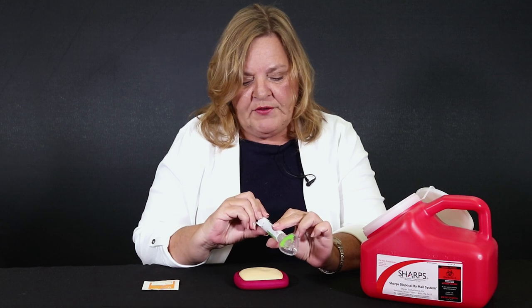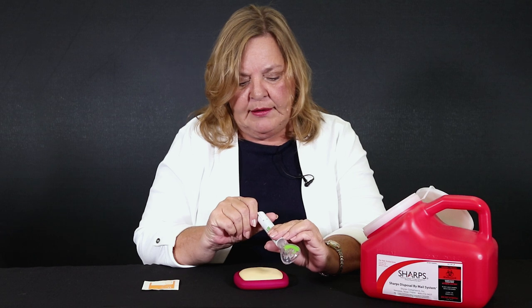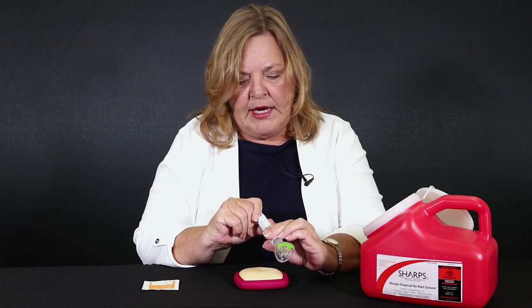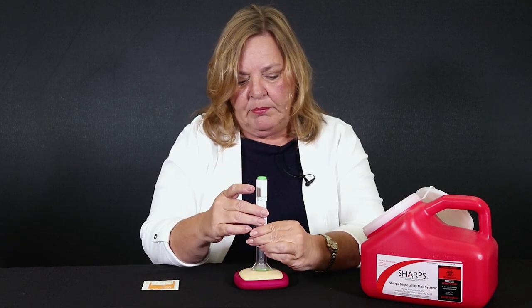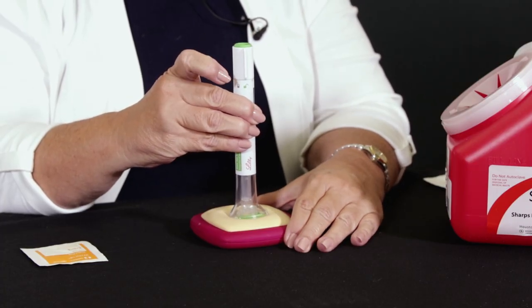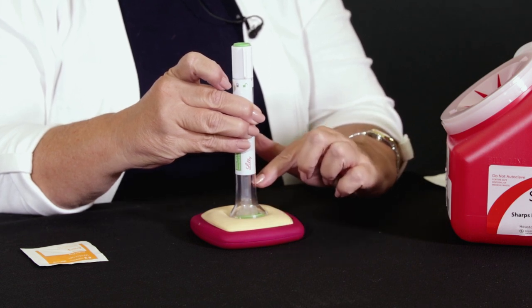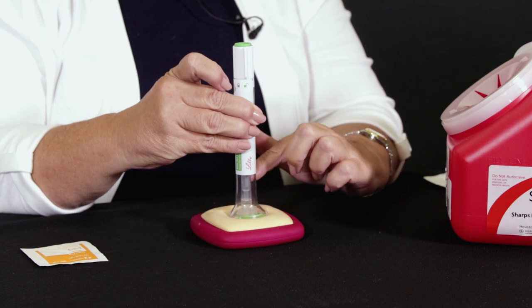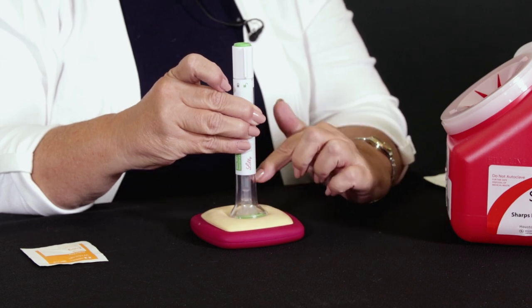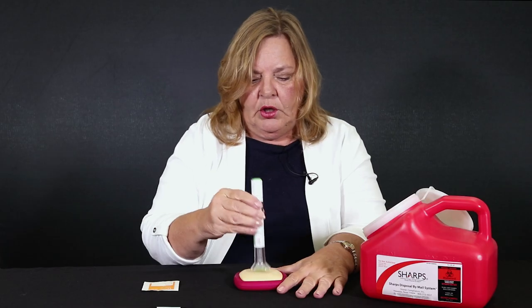There is an on-off switch here at the top. This position means it's locked; this means it's unlocked. So you turn that towards the unlock so that you can't fire it mistakenly. Hold the pen against your skin, click the button, and the medication will be released. You might see a little indicator come down, which shows that it's come all the way down. And if you heard that second click, that means it's completely finished. Take it away and dispose of it in your sharps container.